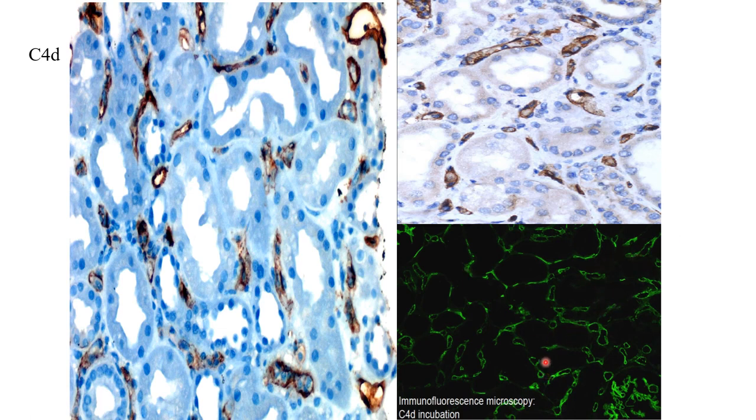So, if the immunofluorescence staining is negative, it is important for you to do the IHC on the other tissue because the two cores are different, and very often the C4d staining starts primarily in the capillaries closer to the medullary regions. Along with the C4d and the histological findings, the DSA levels have to be estimated, wherein if they are positive, we can give a specific diagnosis of active humoral rejection.